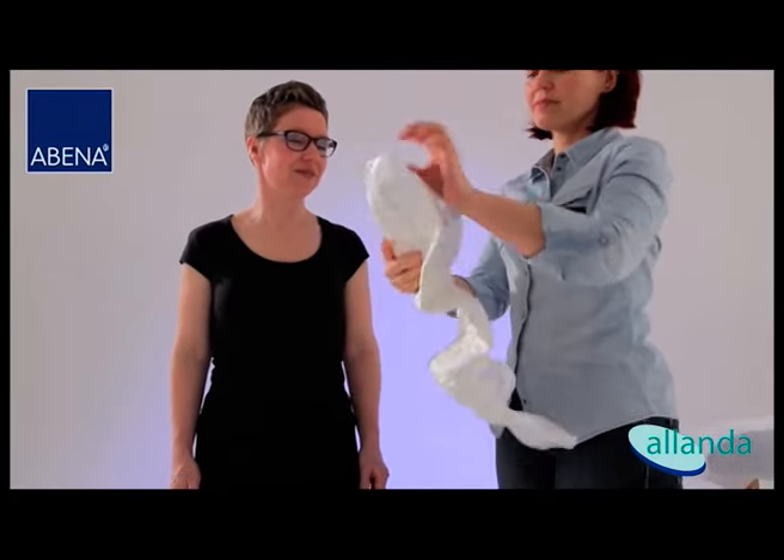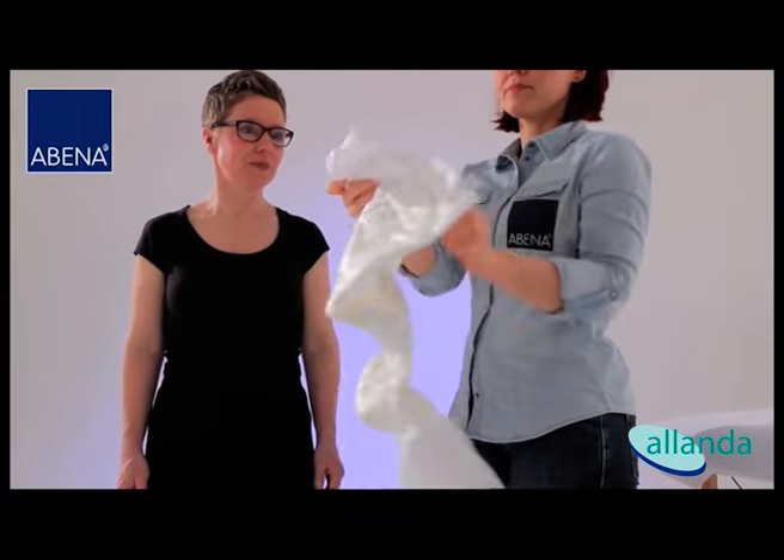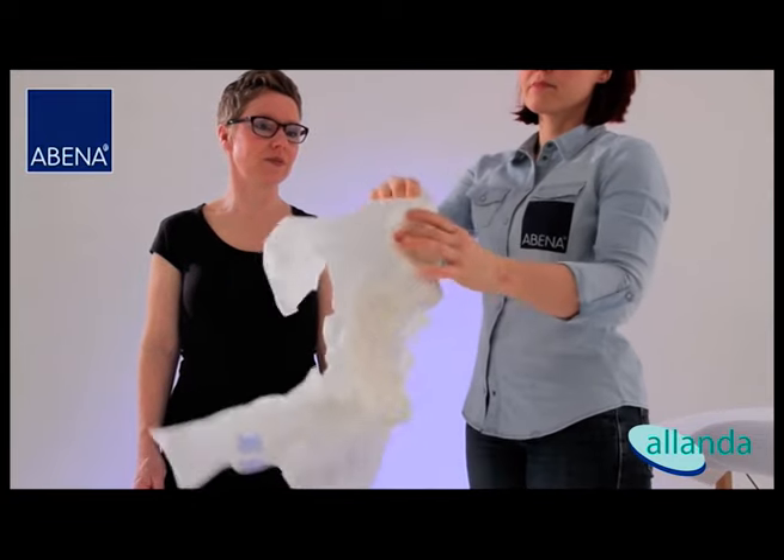Bend the brief lengthways with the back sheet turned outwards and fold the side panels apart. Do not touch the inside of the brief.